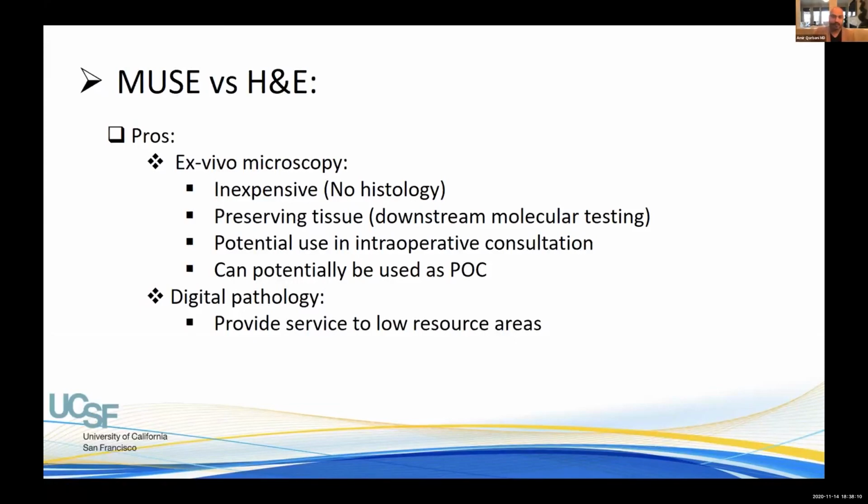when the patient is in the clinic. And it's very fast, and it's digital pathology, so you can provide service to low resource areas. There is no need for a pathologist to be there, because it is all digital and everyone from everywhere can examine it.